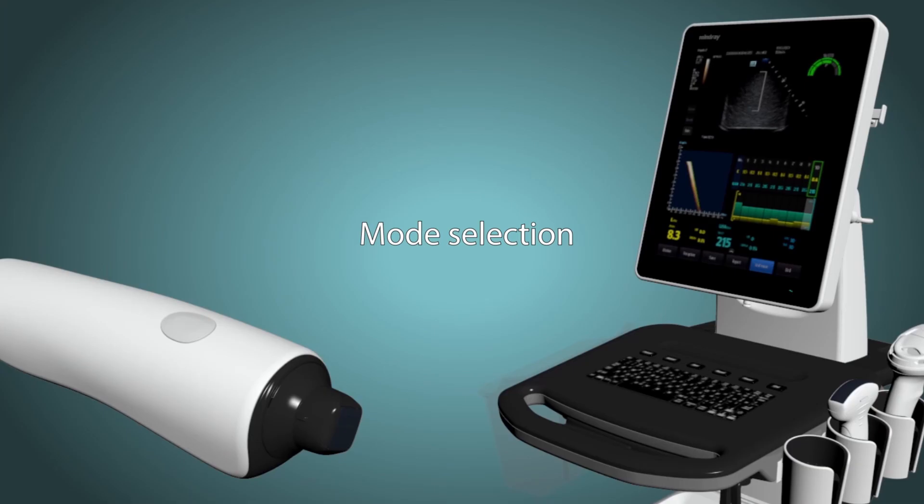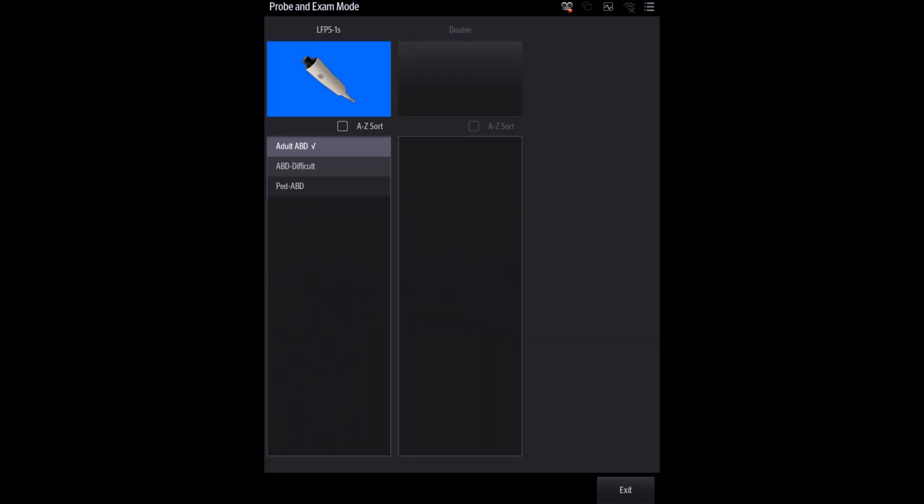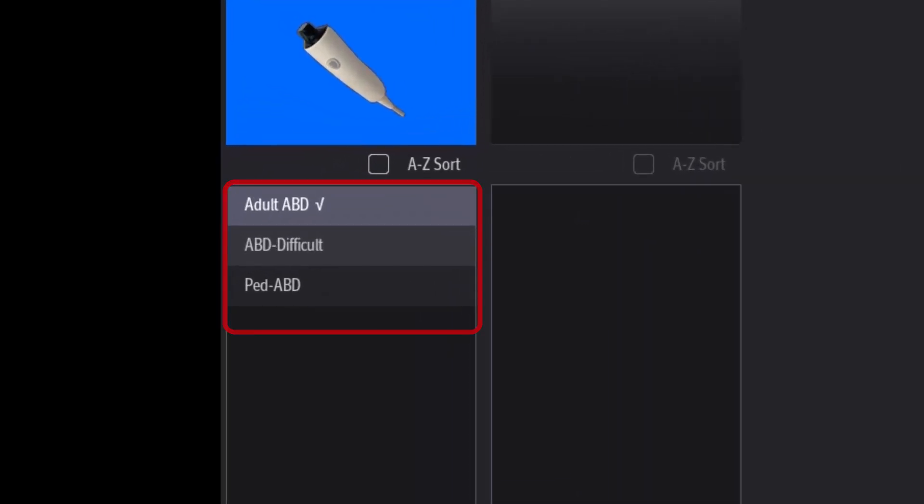Next, select your probe of choice, and then select exam type. The system offers three different exam types for you to choose from: adult abdomen, which is the most common one; high penetration, which is for overweight or obese patients; and the pediatric mode, which is for children.